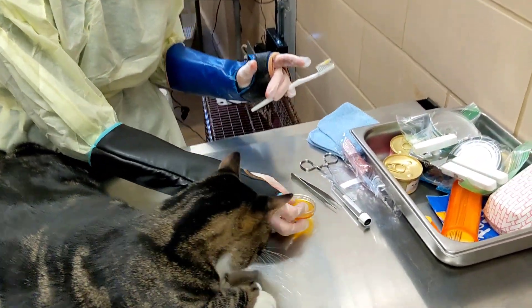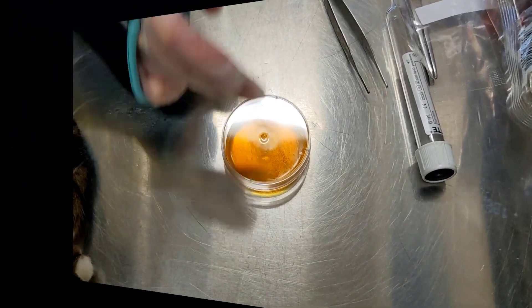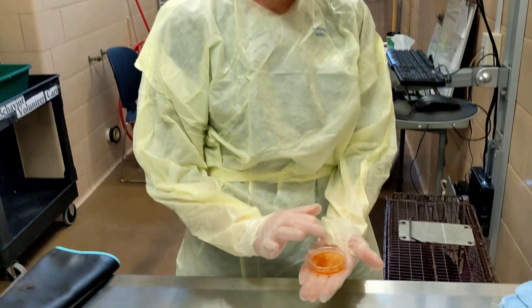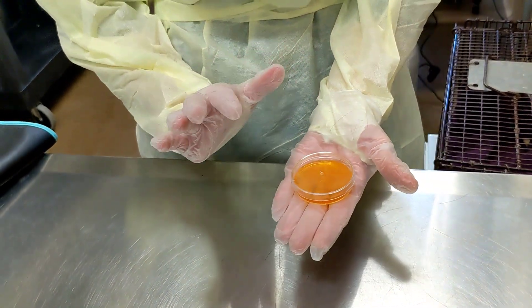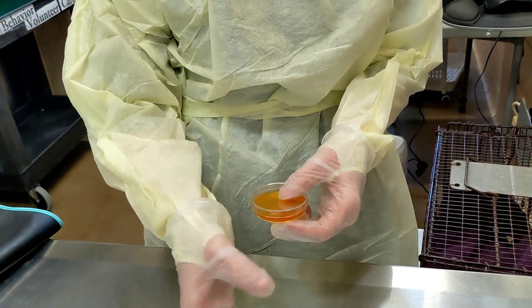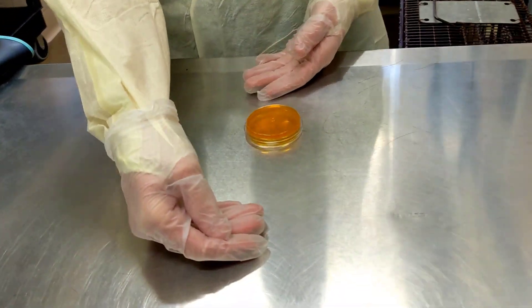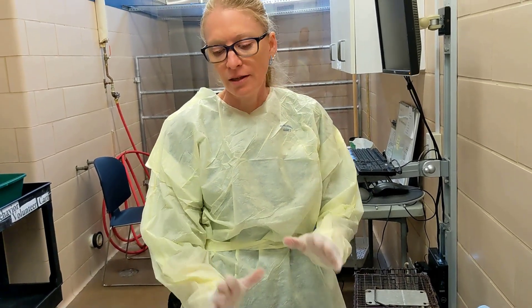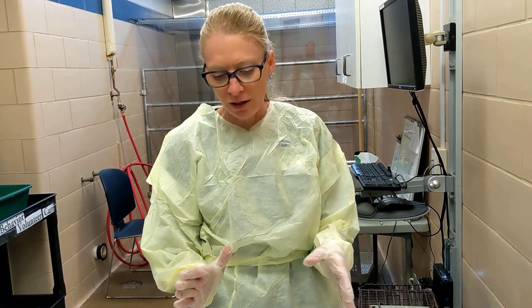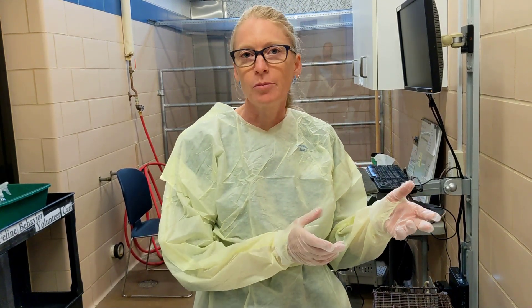Put your lid on and then label the plate with the animal's ID number, the date, and your initials. Then we'll put it in a plastic bag — we tend to use the IDEXX plastic bags. You don't want to zip lock that, so just leave the zip lock part of the bag open. You want to store the plate in the bag upside down, and then put it in the designated area for the DTM cultures. Each site has a slightly different place, but the idea is to store it in a warm, dark place — each location has either a drawer, a little box, or a cupboard.